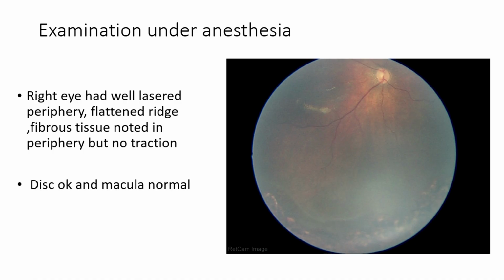The laser scars are a bit away from the fibrosis or the ridge. So maybe it was not adequately lasered, or it is regressed. You're being a lawyer, man. You tell correctly. If you want more information, you will get more information. So you should tell: I think I don't have enough information to tell, or I can't see properly. I would like to see a better picture that tells me more about what is anterior to the ridge. All those things you can tell.